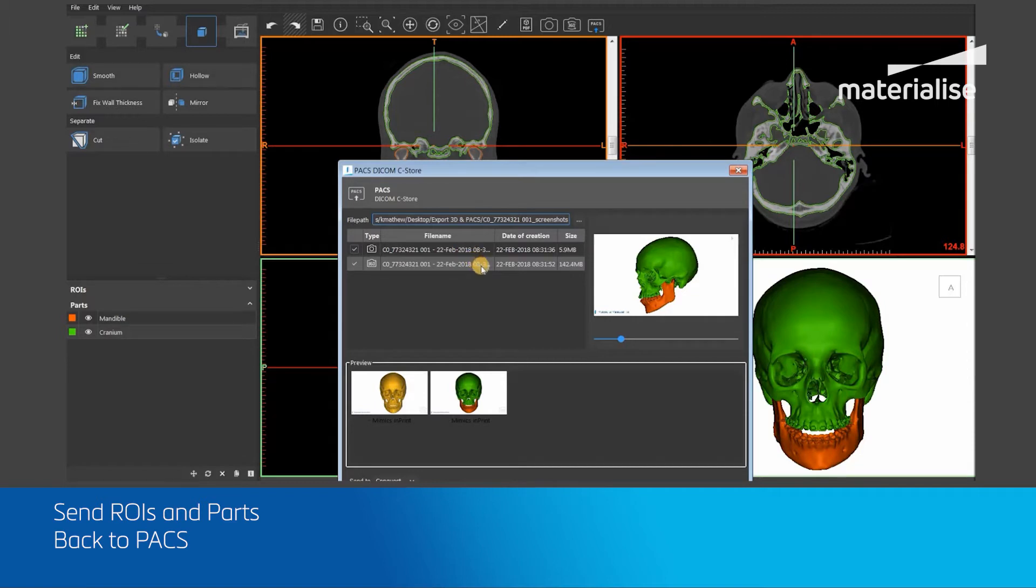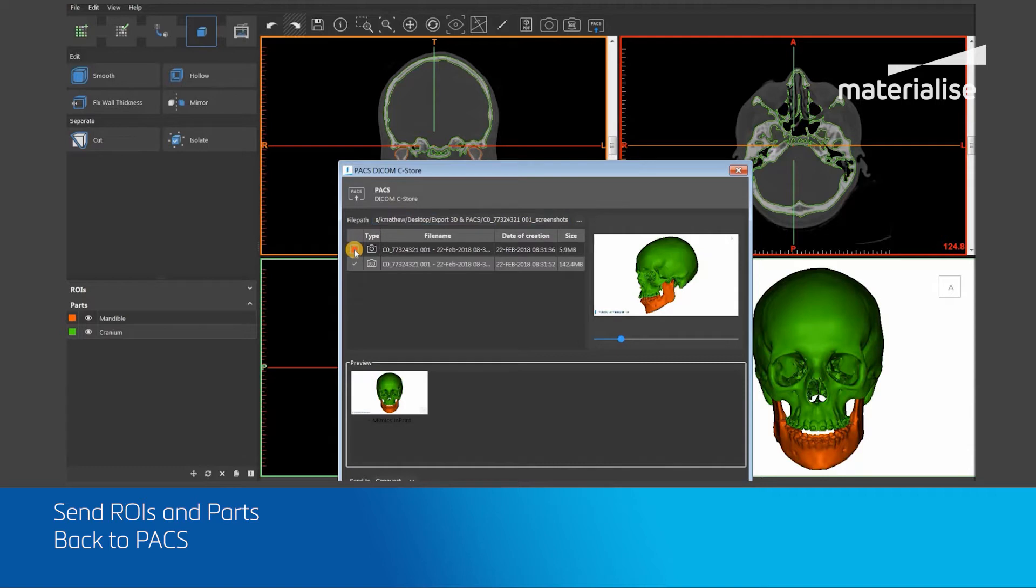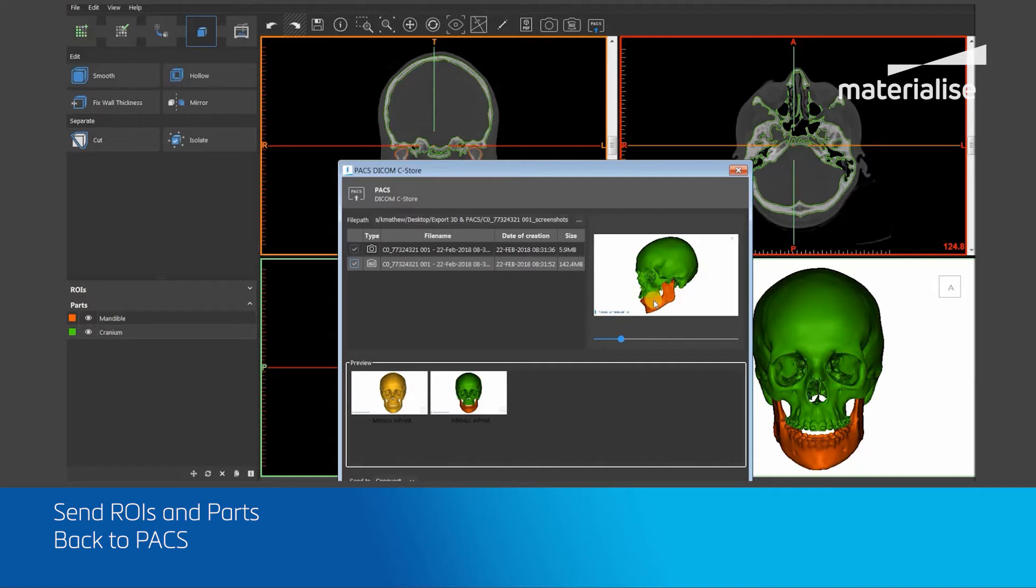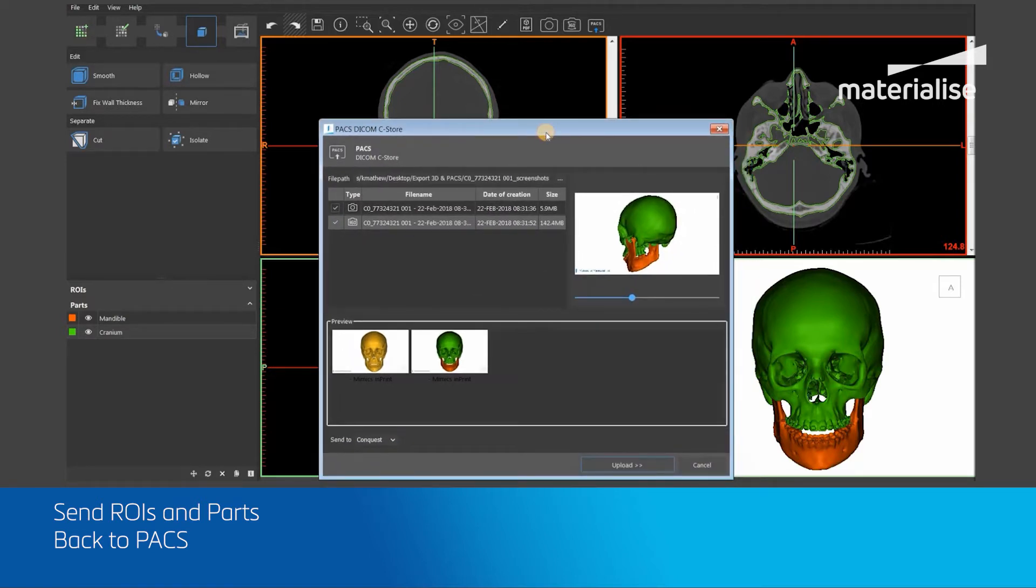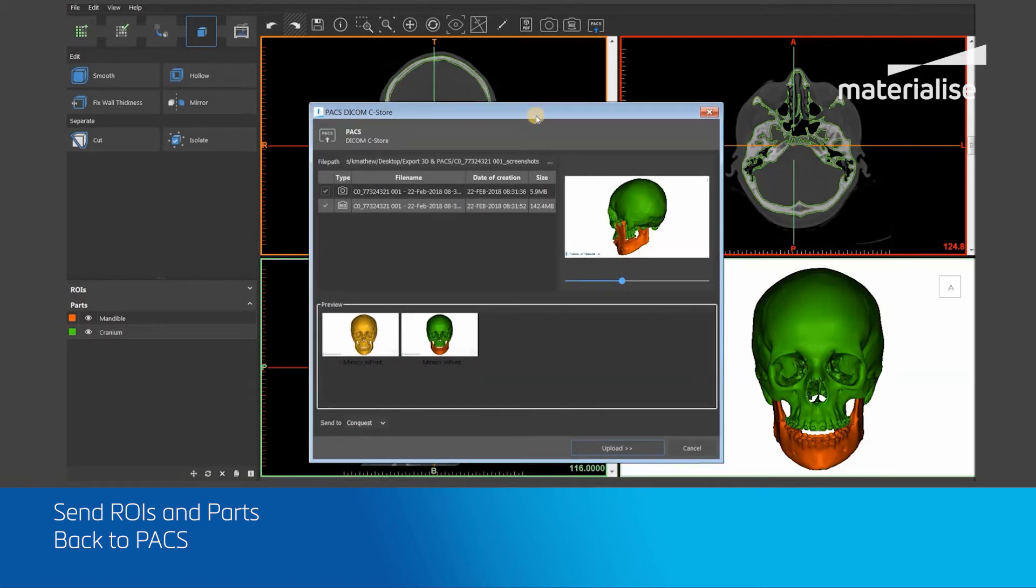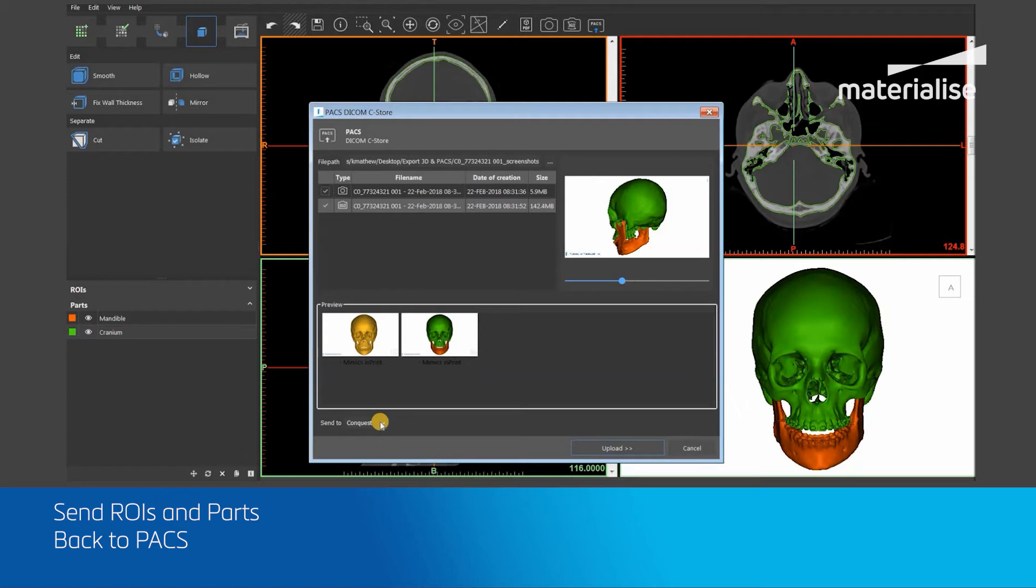I will now select my required 3D views and verify them using the preview pane and slider within the dialog box. Next, I will choose which PACS system I am sending these DICOM files to by clicking on the dropdown menu adjacent to the Send To section. Finally, I will click on the Upload button to upload the selected DICOM files to PACS.